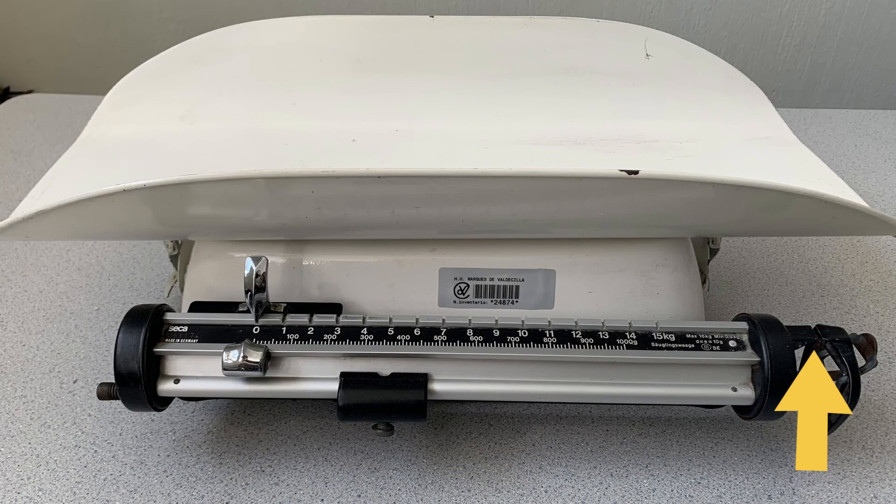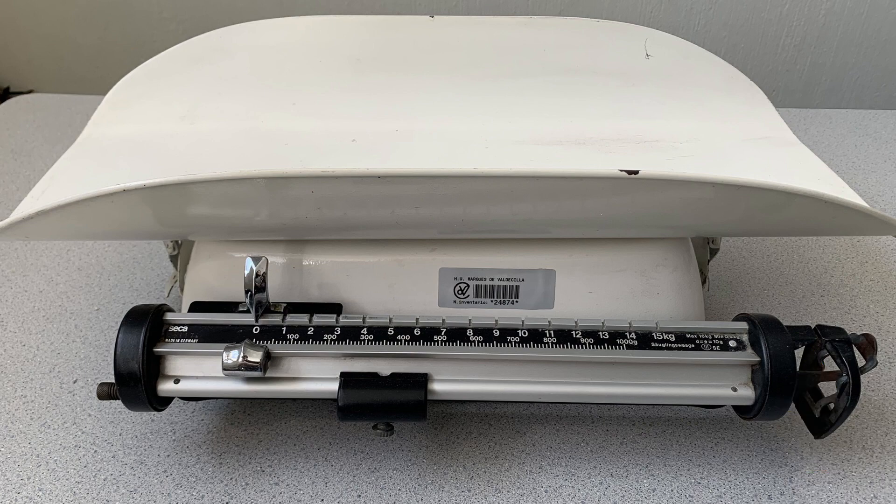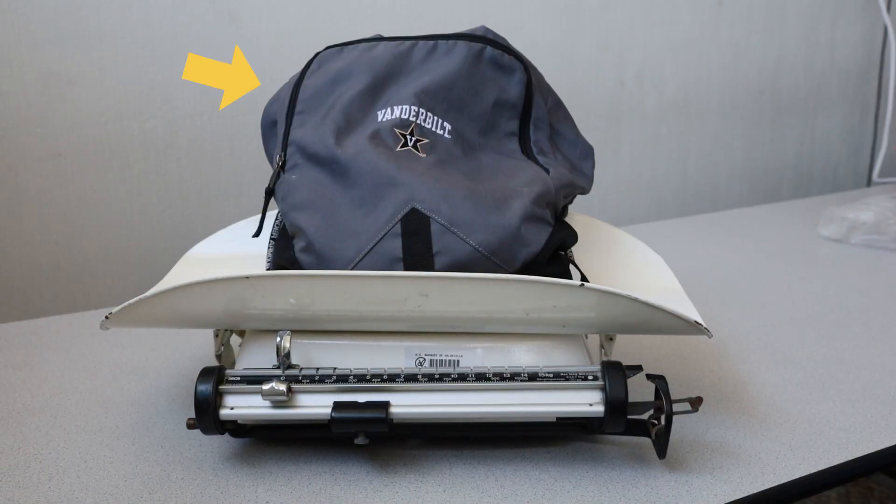To measure an unknown mass, begin by first making sure the scale is level. Once the scale is level, ensure that both the large and the small weights are in their zero location on the railings. Next, place an unknown mass in the weighing basket. The beam balance should be in the elevated position when the unknown weight is placed in the basket.